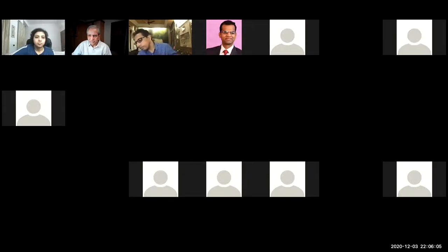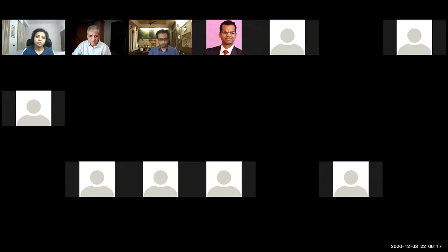Yeah, and one more common mistake which I have seen in residents while doing the cases. As Nagraj sir said, one problem is the zoom in and zoom out. Usually they'll be doing with 0.4x or 0.6x. That is one thing. The other thing is they will always be concentrating at the tip of the instrument and they'll totally forget what's happening at the wound. So they'll put undue pressure at the wound, especially during lens delivery.